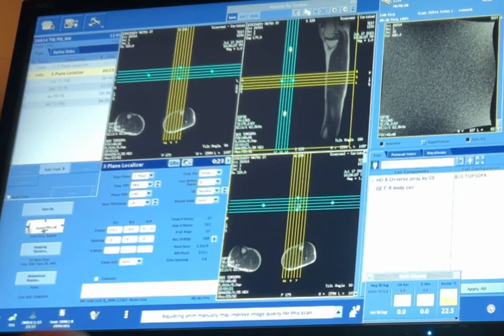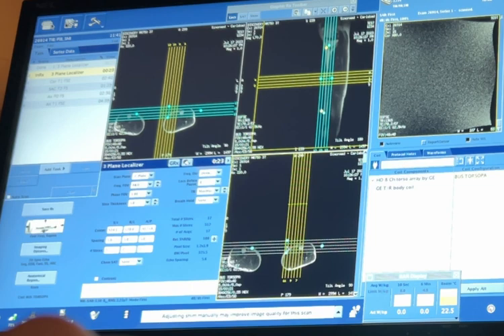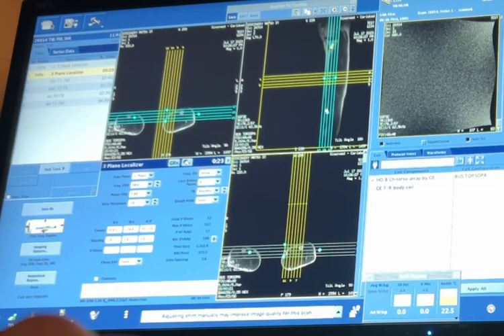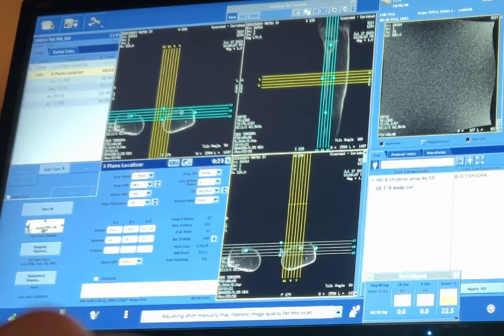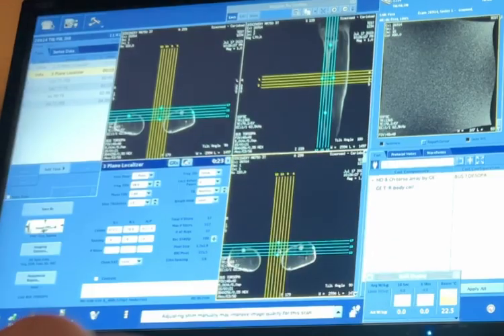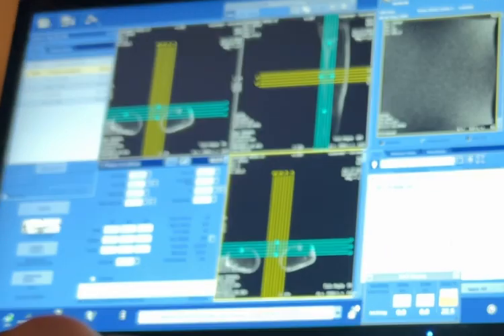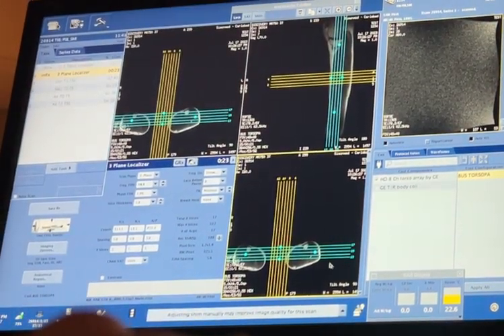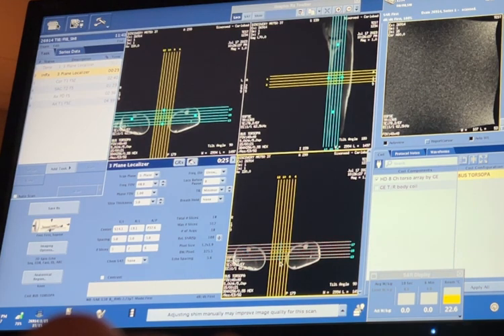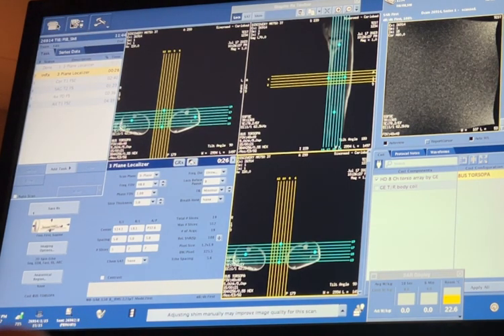Okay. Yeah. Does it have to be centered or? I'd center it, yeah. Left to right. And then I would move it down a little bit. Yeah, perfect. Right there. Okay. Yeah, that looks good. Maybe add one up top and one below. And then, yeah, that looks good. So let's run. Yeah, because I checked it there and that looks good. So let's save and scan.